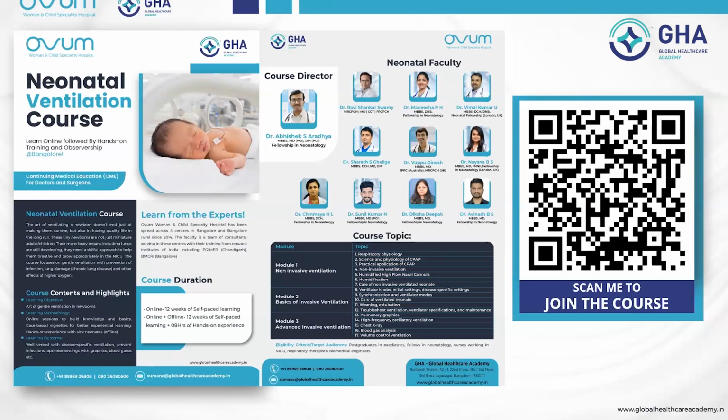There's a question on reuse, ETO, or autoclave. I think it's a very difficult question to answer. But see, all this is optimization. Suppose you have used the circuit for 4 hours or 12 hours for a baby and the circuit is good. But before that, you should know the principles of ETO. ETO will not work if it's a wet circuit.